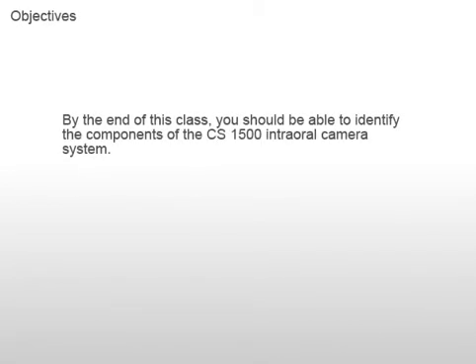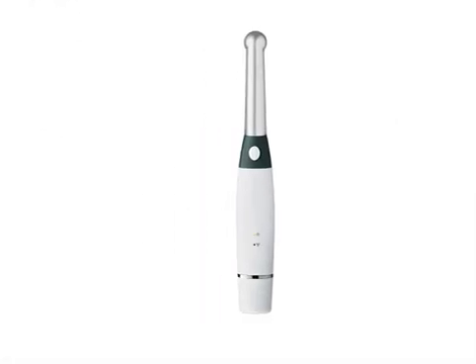In this class, you'll get an overview of the CS1500 system's main components. The CS1500 intraoral camera comes in two versions: wireless and USB. This class covers the components for both. Let's begin with the heart of the system, the camera.